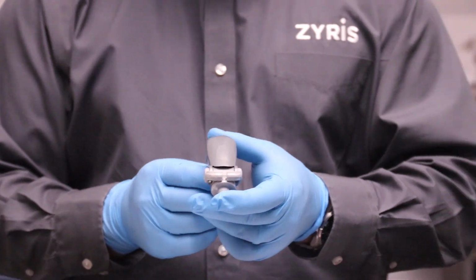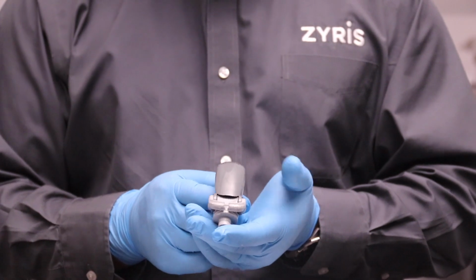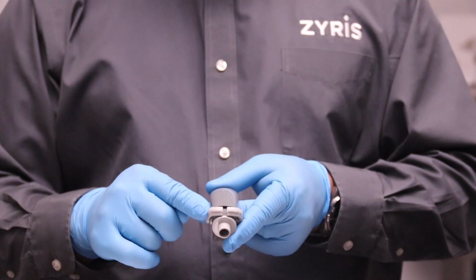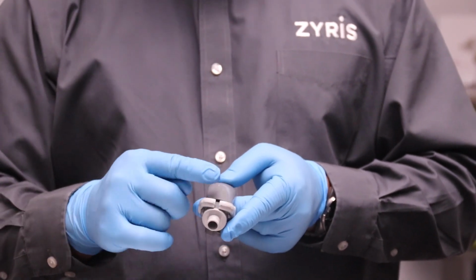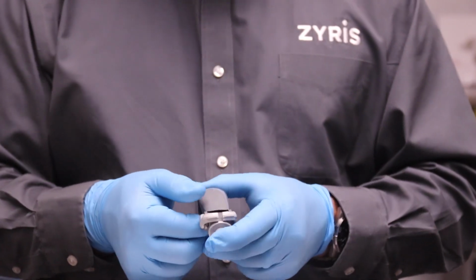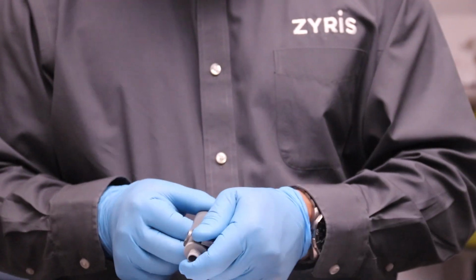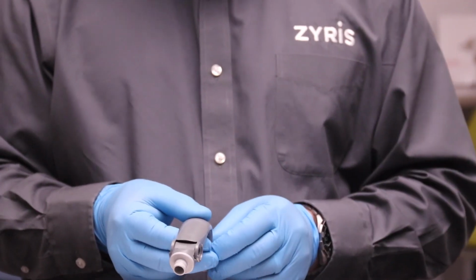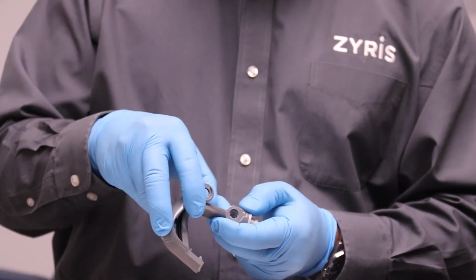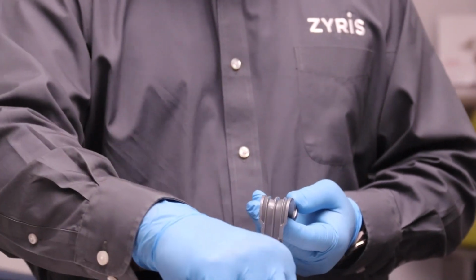In order to clean the Isolite core posterior control head effectively, it needs to be disassembled. There's an upper and lower half and two levers that need to be removed in order to open up the control head. To do that, take your control head and drive the levers down towards the base until they pop off. Do that to one side and then do it to the other side. To separate the upper and lower halves, hold it at the bottom and using your thumb, separate the bottom and the two halves will open, giving you access inside the control head.